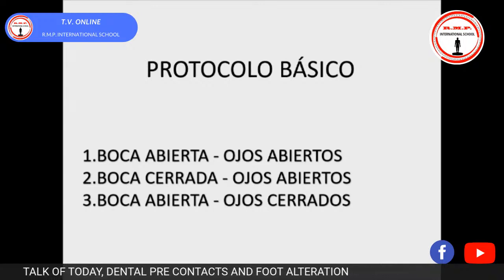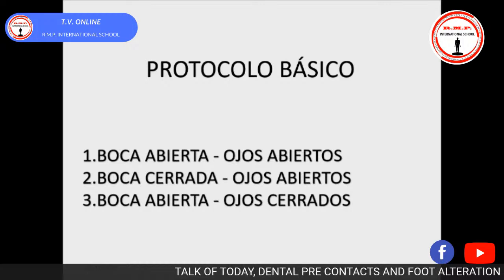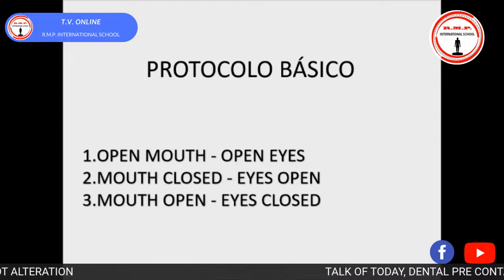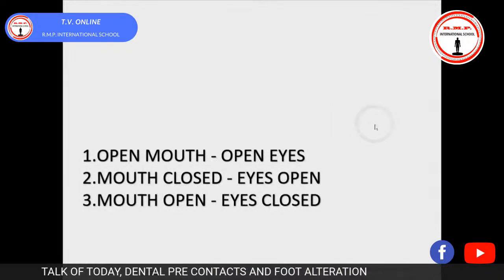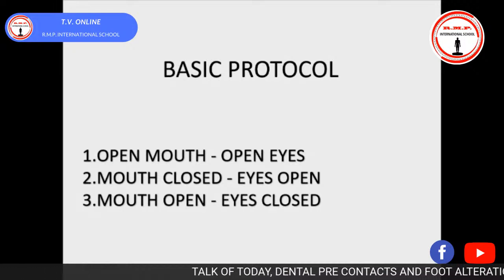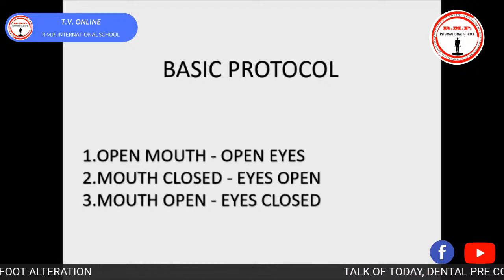Don't be worried, we have three different loads. This is the basic protocol, and we can analyze these three loads. Let me put it better. Okay, we have it in English now. This is the basic protocol: mouth open, eyes open; mouth closed, eyes open; mouth open, eyes closed.